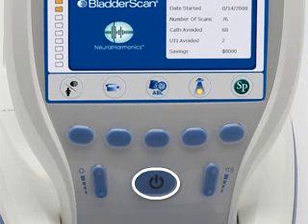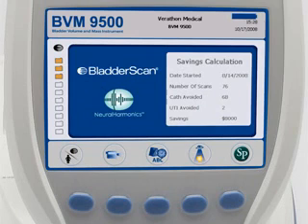Turn on the unit by pressing the power on-off button. To measure bladder volume, the BVM9500 is designed to scan in two patient-specific modes. Select the proper exam mode to ensure the accuracy of your scan.